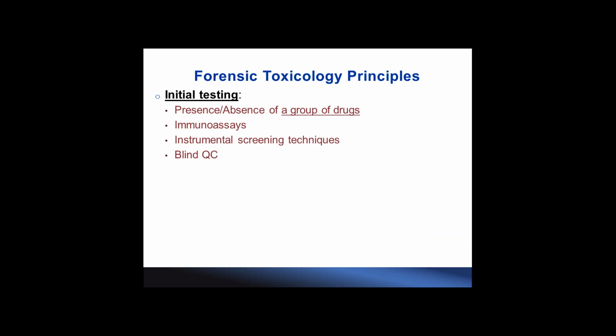Currently, we can't have the immunoassays that are appropriate for this specimen type. So what we do is, principally it's the same technique. We have the LC-MS-MS method set up. When it screens for the first time, we only look at the quantitation ion transition, if you know the terminology.